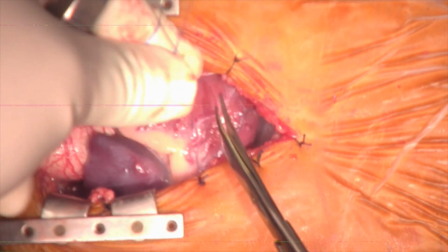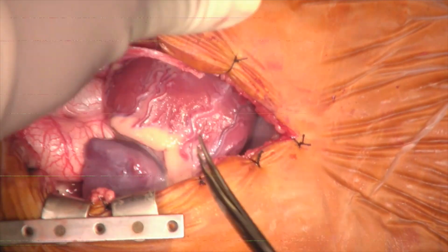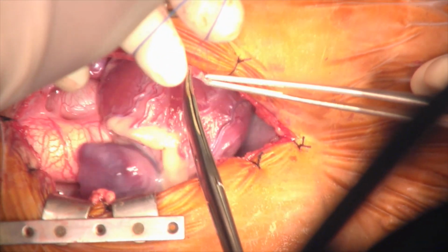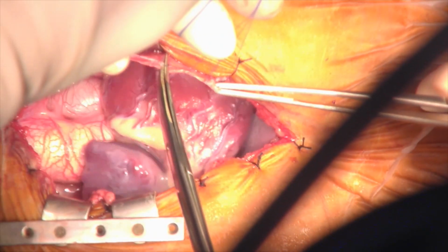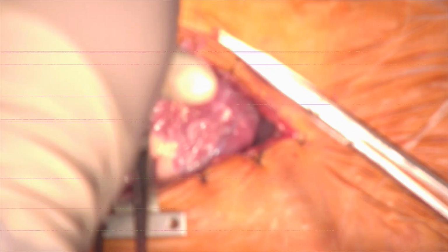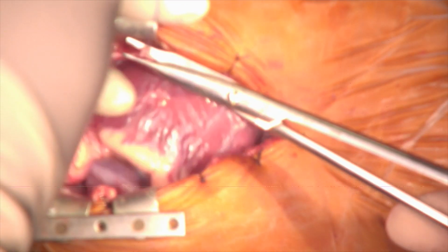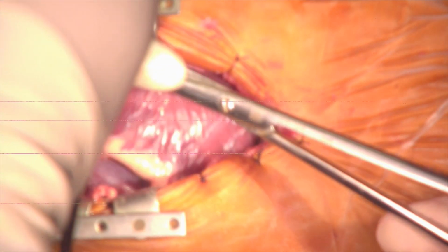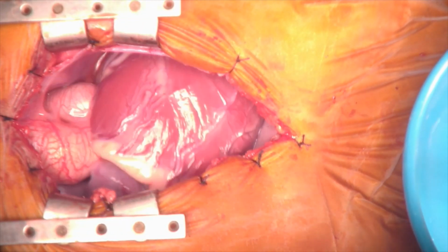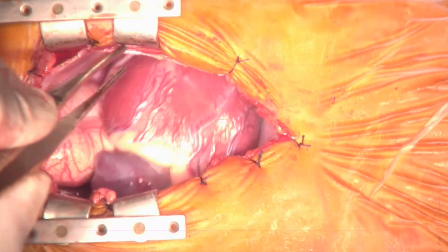The pericardium is cut out around the sutures, producing 5 pledgeted sutures for use during the ventricular septal defect repair later. The freshly cut edge of the pericardium is then treated with diathermy for haemostasis.